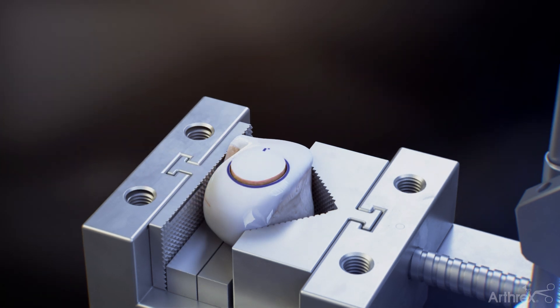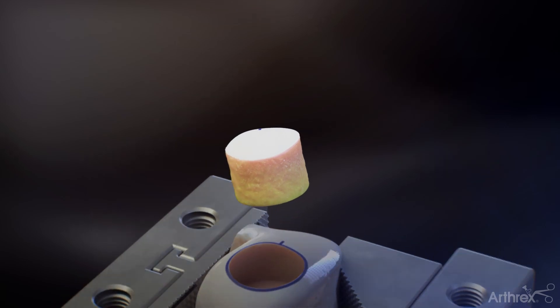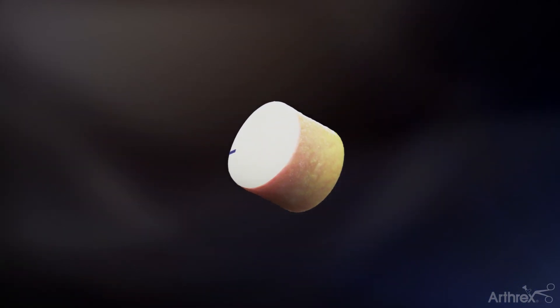An alternative method would be to ream through the entirety of the allograft and use the collared guide pin to gently extract the graft.